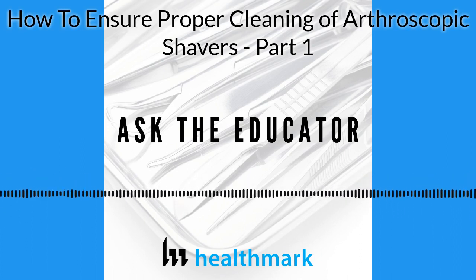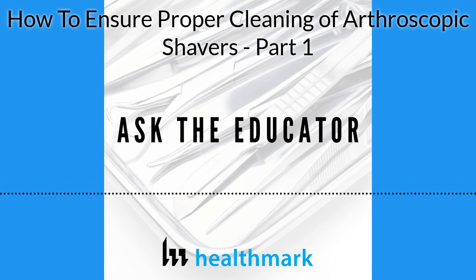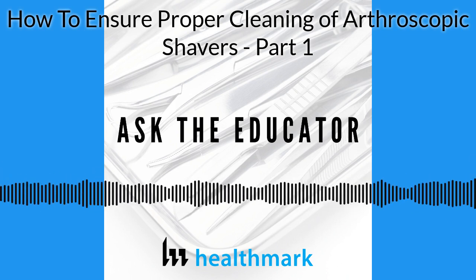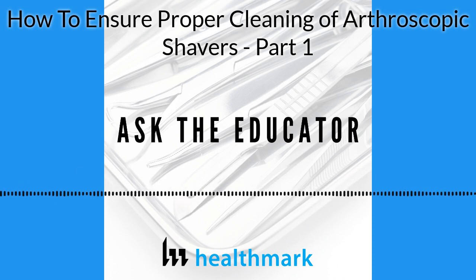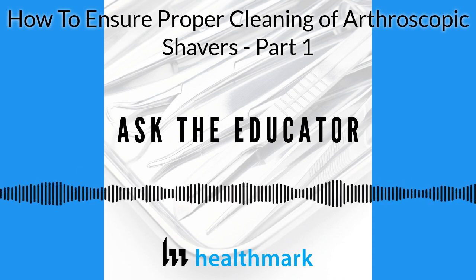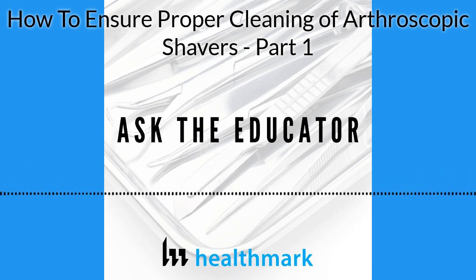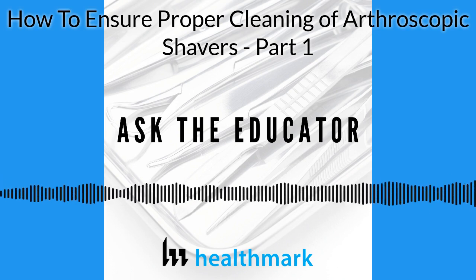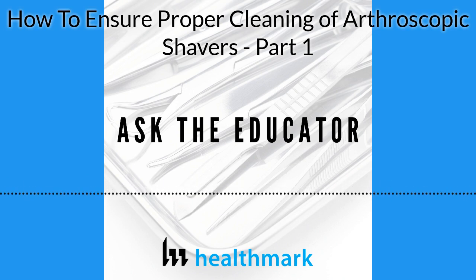Just to recap what we covered in the show, we addressed the question, how do I ensure proper cleaning of arthroscopic shavers? We then talked about the need to audit your ready-for-use shavers, and that you need to know the IFU and what is required to inspect. Lastly, we discussed the need to use a borescope to thoroughly inspect and document your findings. Please join us next time when we pick up where we left off and talk about ensuring proper cleaning of shavers on the decontam side.